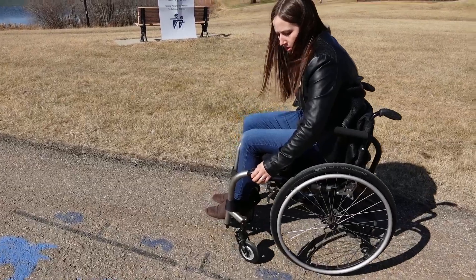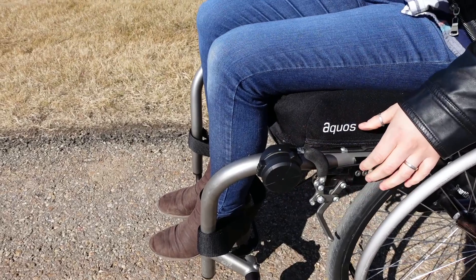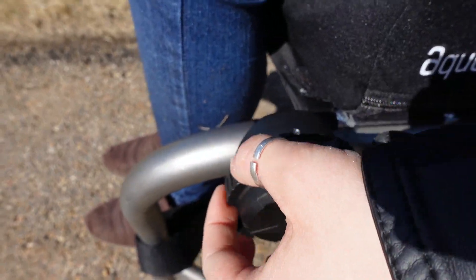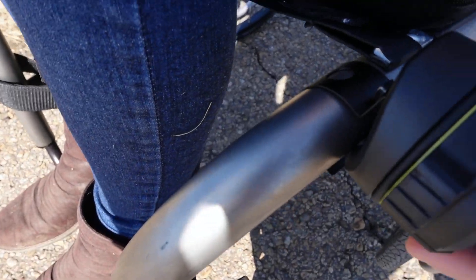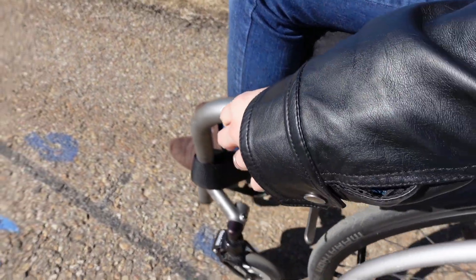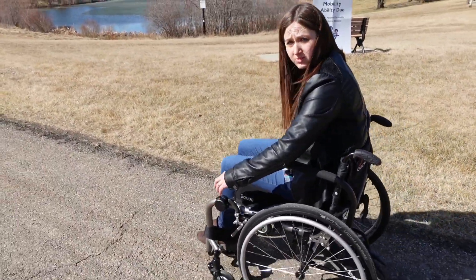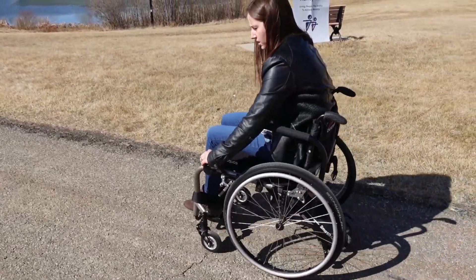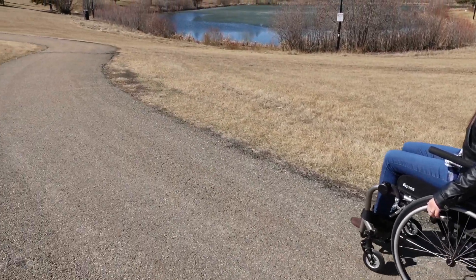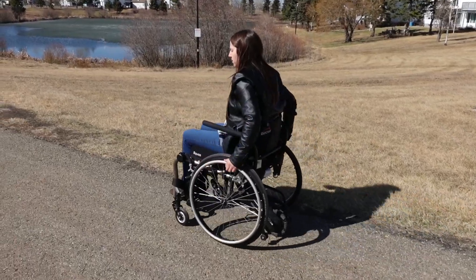So how do you access this, Cass? You just press in. So I turned it off — just turn it back on. These little notches here are what you use — this is your speed control. You're going right now, pretty slow Bills. You just turn the dial up and way to go! And then you just steer and you're going down these trails. It's just helping me assist. If I need to propel, I still can. The power add-on unit doesn't weigh too much.